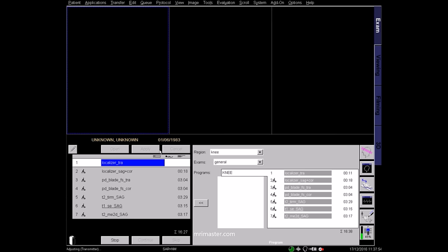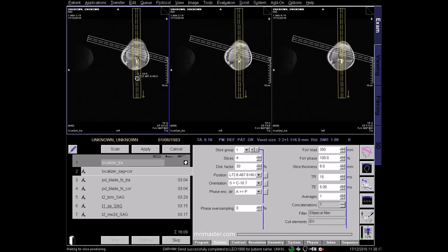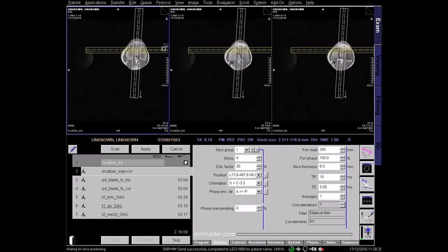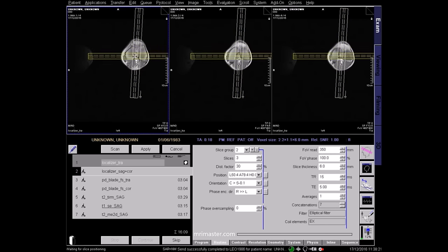Begin the scan with an axial localiser sequence. From the axial localiser you can plan the sagittal and coronal localiser parallel and perpendicular to the medial and lateral condyles.